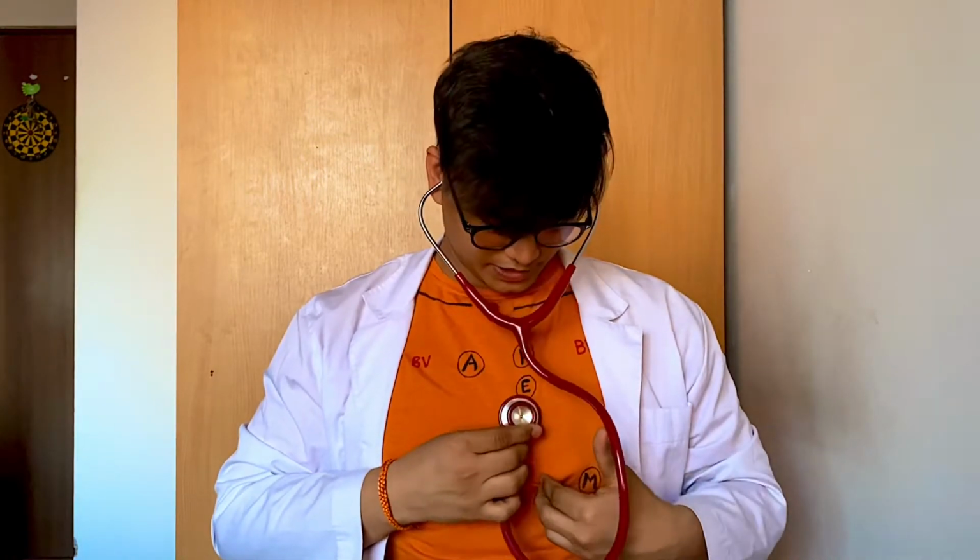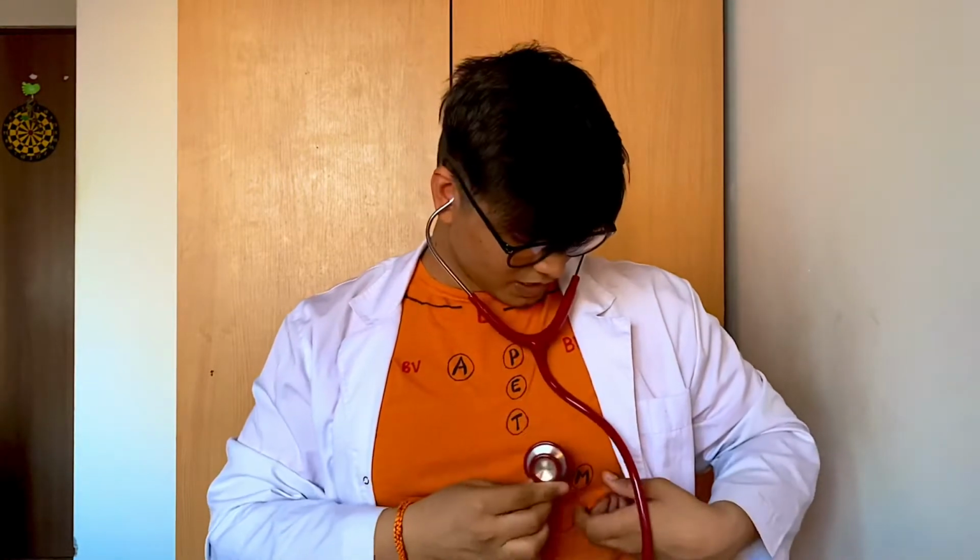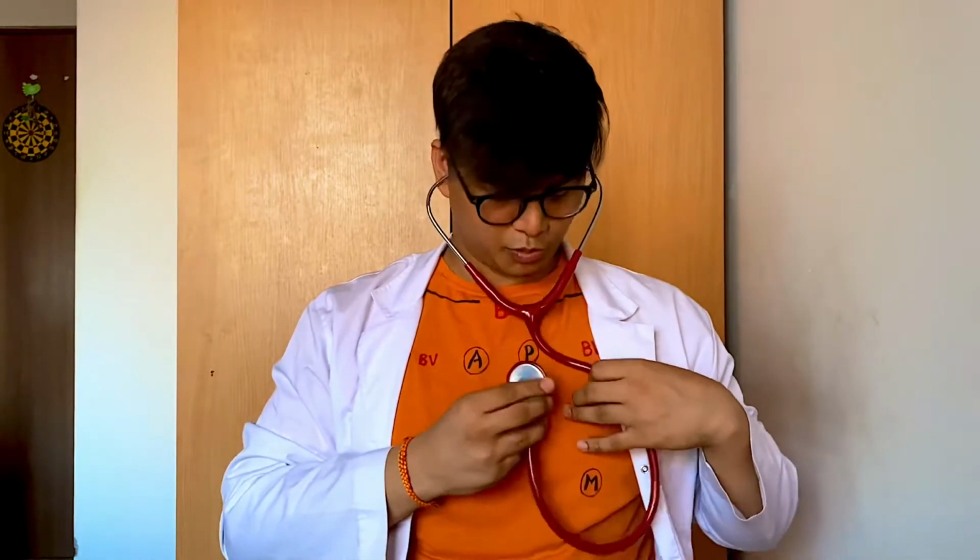First is the sound of aortic auscultation point. Now is the sound of the pulmonary auscultation point. Now is the sound of tricuspid auscultation point. And now is the mitral. And for the Erb's point, the murmurs, you have to activate the bell, and here is the sound of Erb's point.